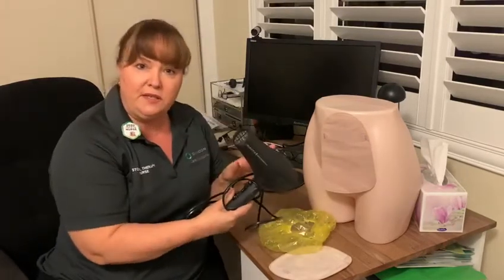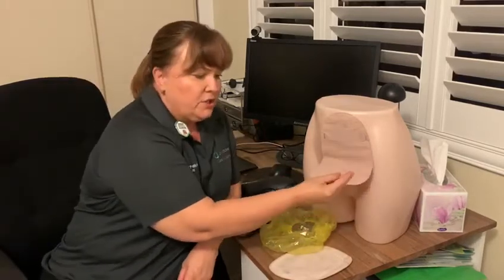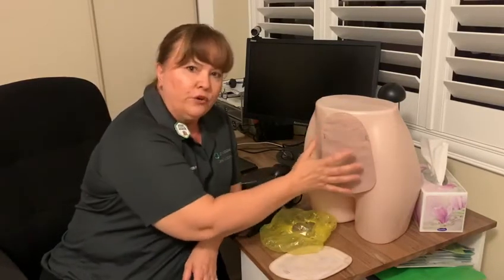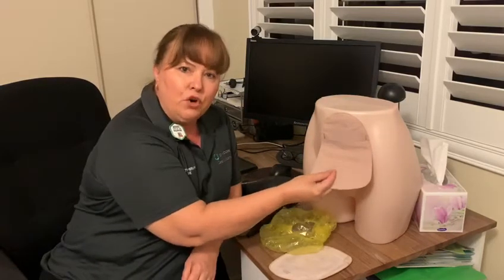Some people will use their trusty hairdryer. Just make sure that if you are using a hairdryer to dry off this fabric, you only use it for a short period and do not use it on a hot setting. You do not want to create a lot of heat around your stomal area — just a little bit to dry off the fabric.